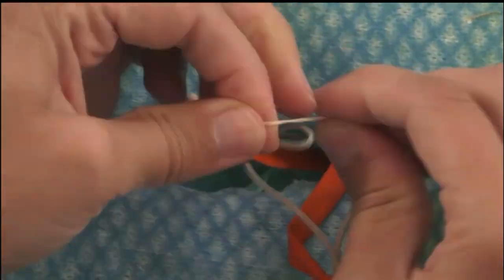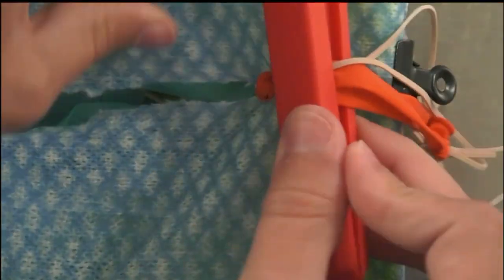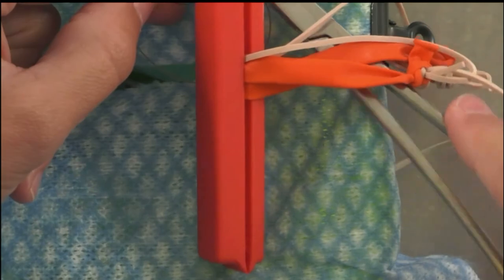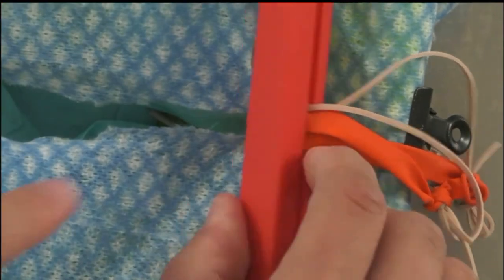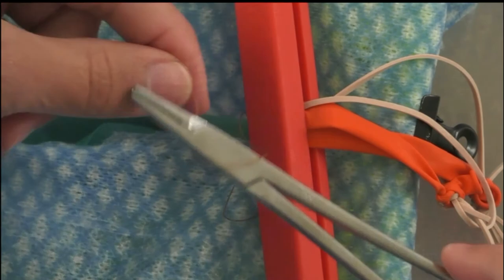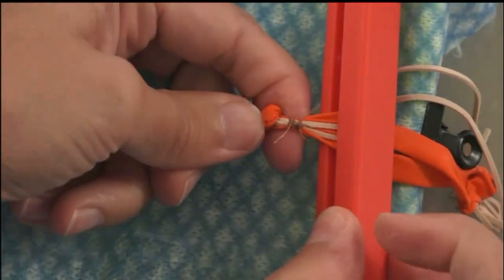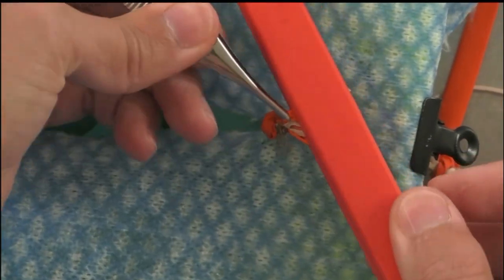Break the round ligaments. When ligating the uterus with the chip clip already applied, make sure your ligatures are far enough from your hemostat that it's not fanning the tissue out preventing a good waist. If you're not proximal enough, flash your hemostat — temporarily release the pressure, get the waist, then reapply. Transect, then re-grasp with thumb forceps, making sure it's not bleeding.